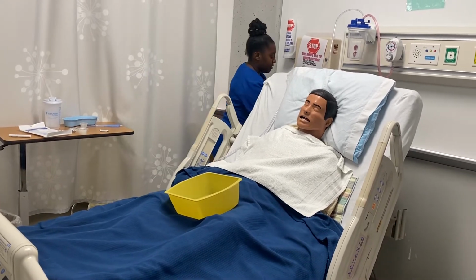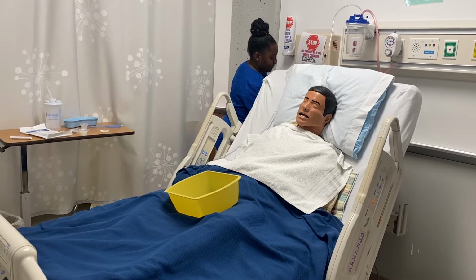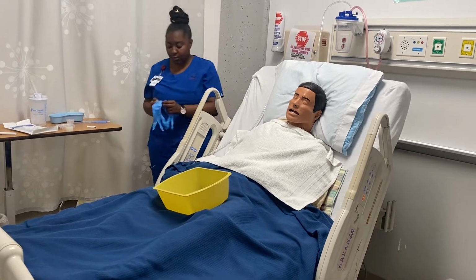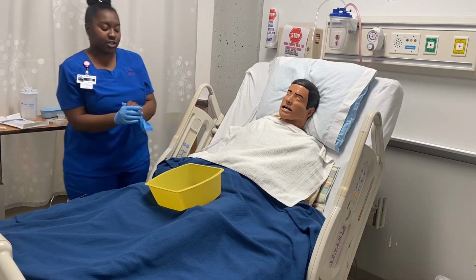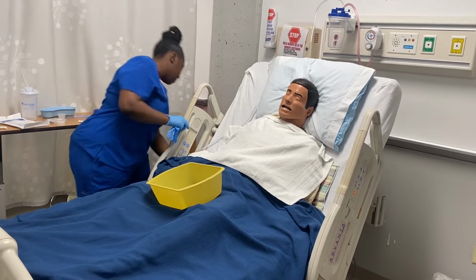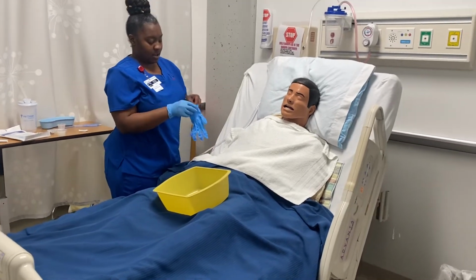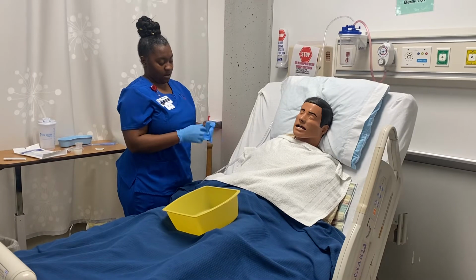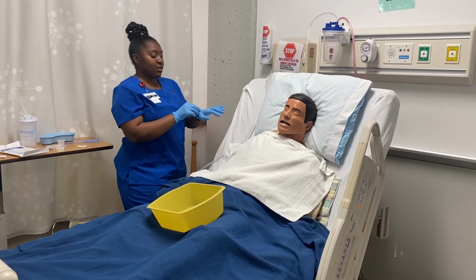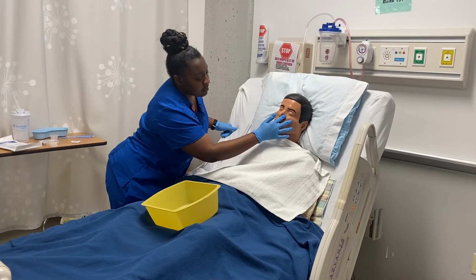So I'm gonna start with assessing my patient's nose. And this should help you. It might be a little bit uncomfortable. We're going to try some things like taking deep breaths and doing some things to help you. Okay. All right, so once I put my finger over your nose, I'll have you breathe in and out just to make sure that you breathe. Ready? Perfect.